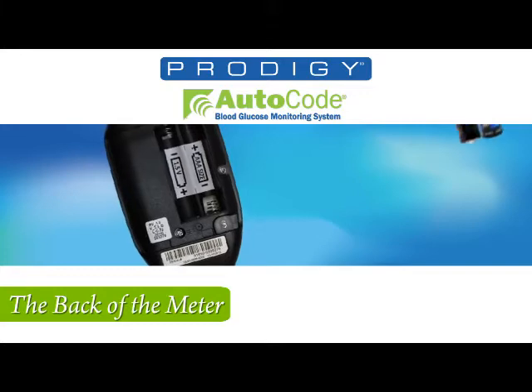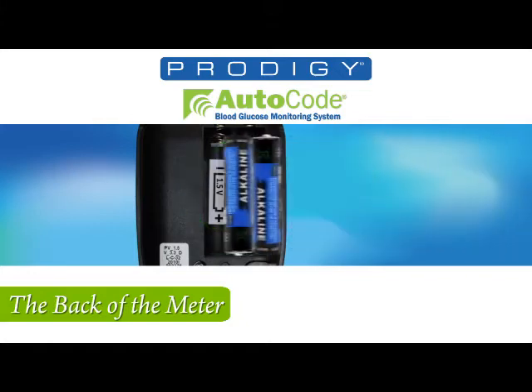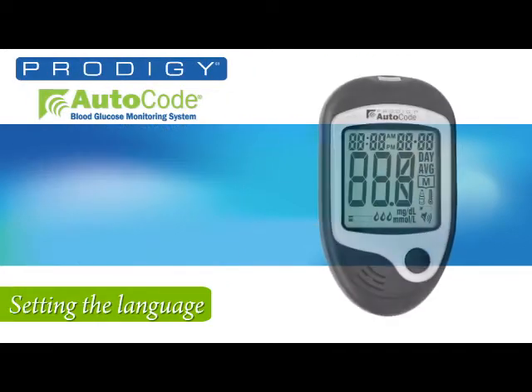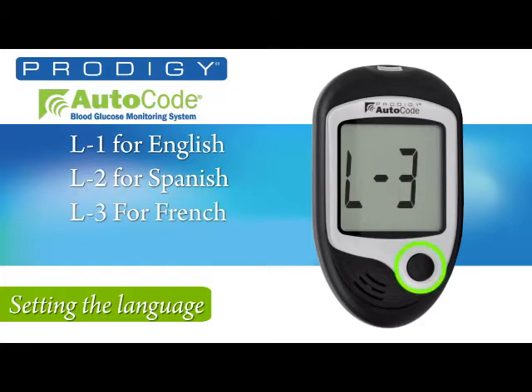First, start in the back of the meter by inserting the batteries. The sticker in the battery compartment ensures the batteries are oriented properly. With the batteries installed, press the set button and flip over the meter without reattaching the back plate. Use the M button on the front to select the language you want: L1 for English, L2 for Spanish, L3 for French, and L4 for Arabic.